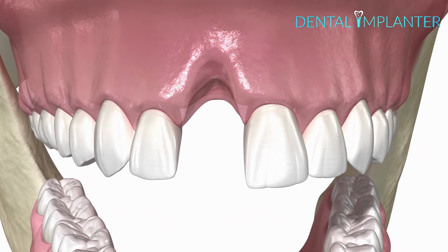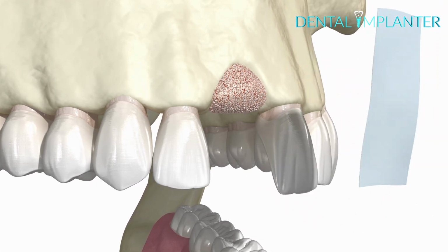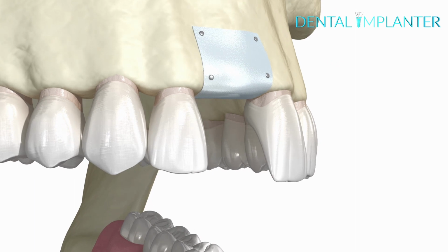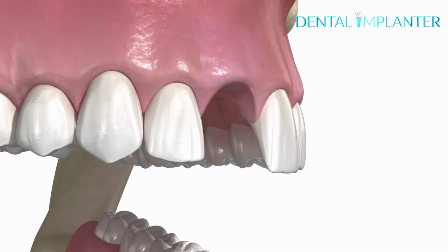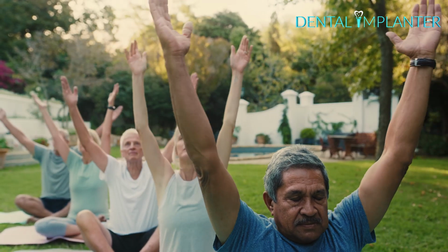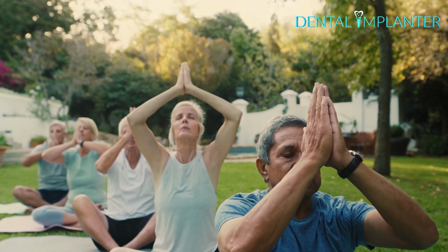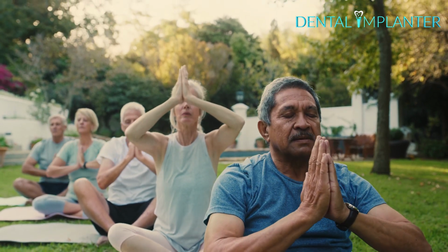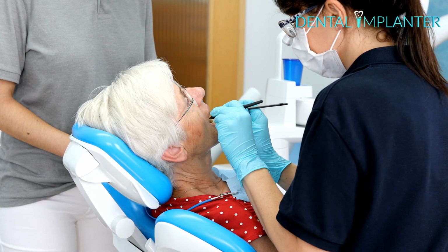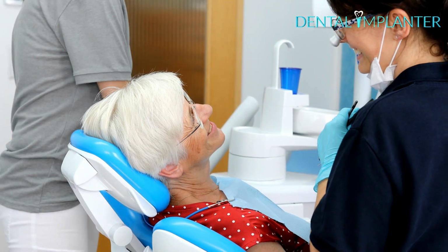It's important to note that not everyone is a candidate for dental implants. Adequate bone density is required for successful implantation. If the bone is insufficient, bone grafting may be necessary. The success of dental implants also depends on factors such as oral hygiene, overall health, and lifestyle. Regular dental checkups and good oral hygiene practices are crucial to maintaining the health of dental implants.